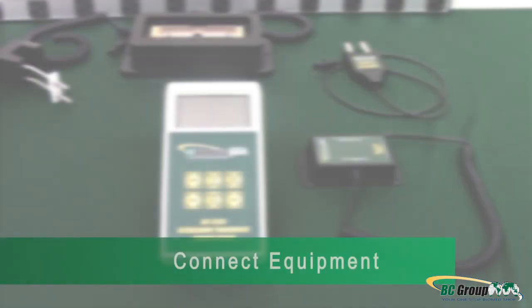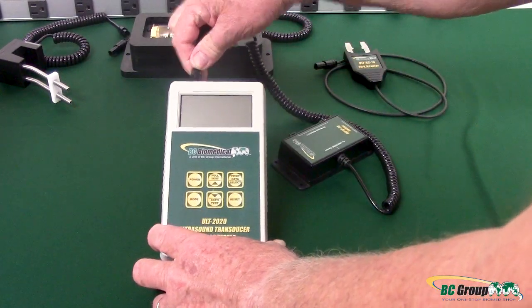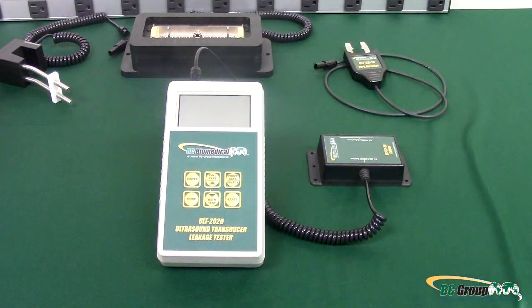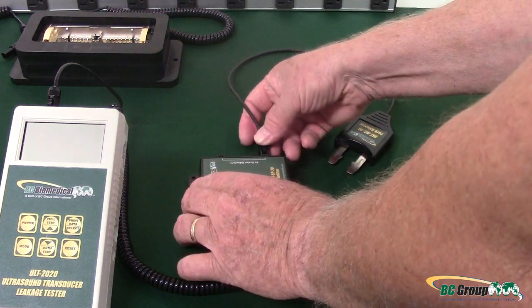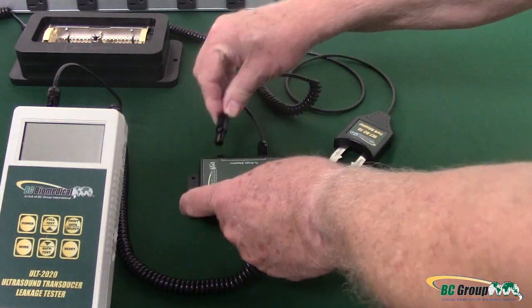Step 2: Connect equipment. Begin by plugging the splitter into one of the two ports on the top of your ultrasound leakage tester. You can use either port. Plug your fork adapter into one of the ports on the splitter, then plug your ultrasound leakage adapter into the other port on the splitter.